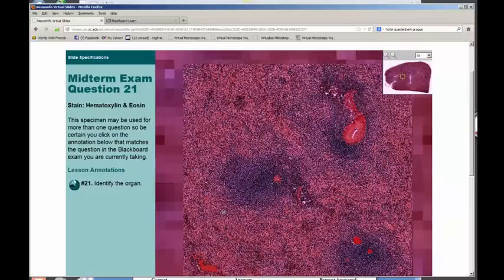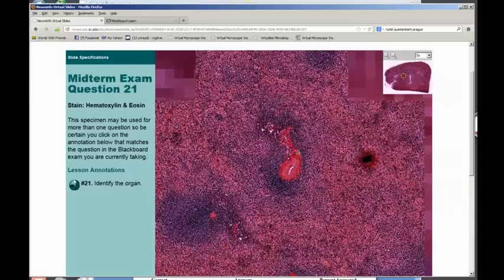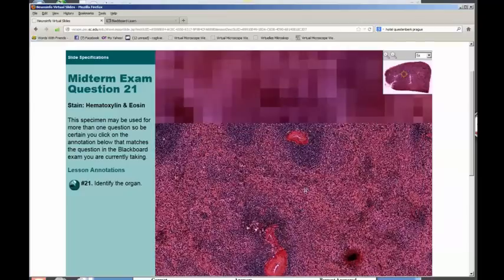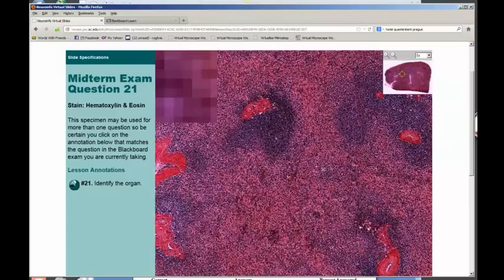Here is a central artery with a nodule that's very dormant, non-active. It would be a primary nodule with no germinal center. But here is a central artery going along a longitudinal pathway. Around that, remember, is the periarterial lymphatic sheath, and that's where the T lymphocytes are located. The nodules are where the B lymphocytes are located.